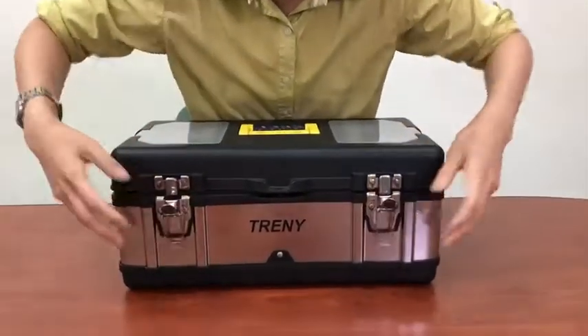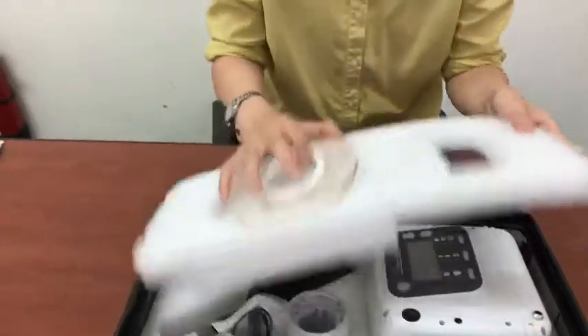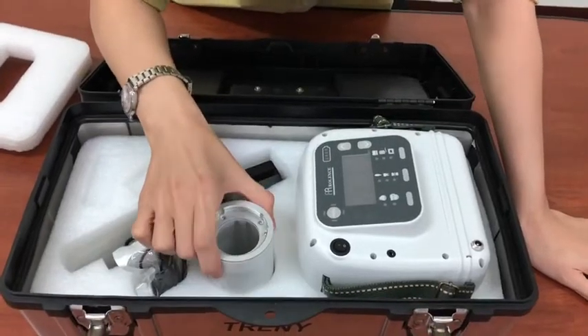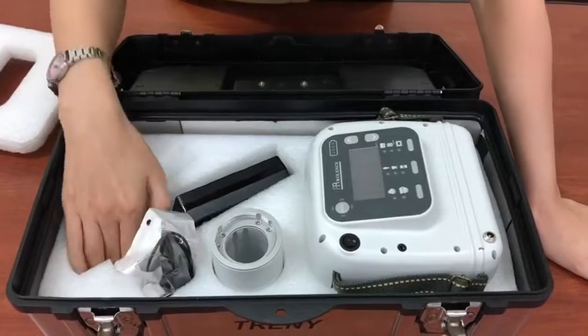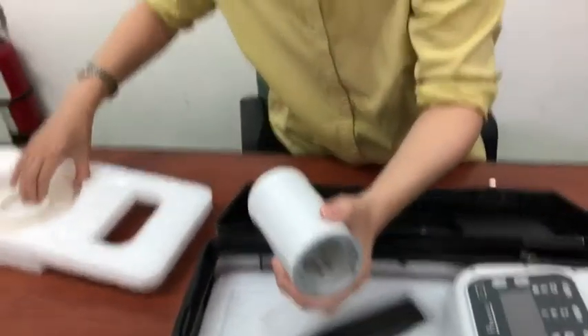So when you open the case, you will see the shield — the back shield on the top, which is the option. And you will see the main device, the limiting device, remote switch, and adapter with power cord.